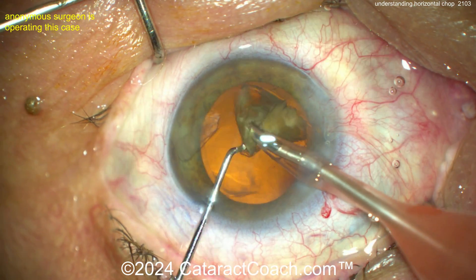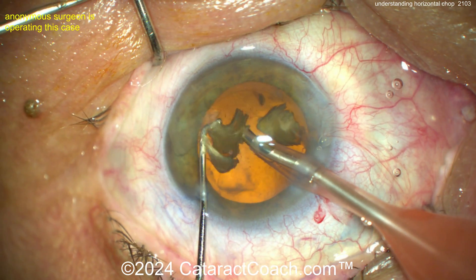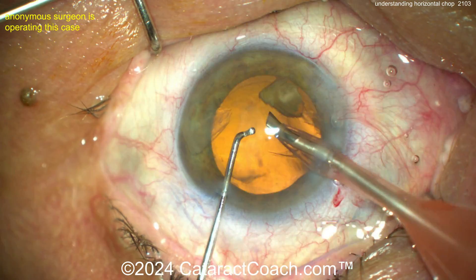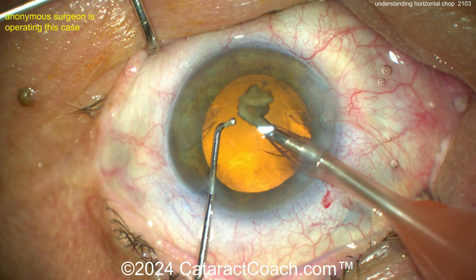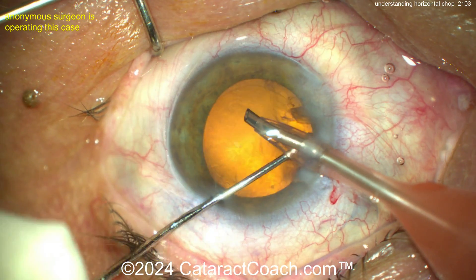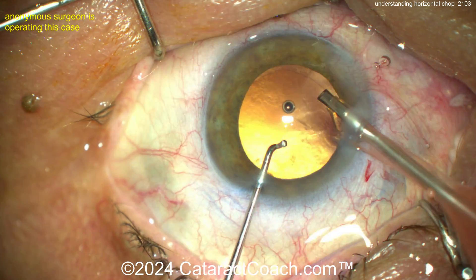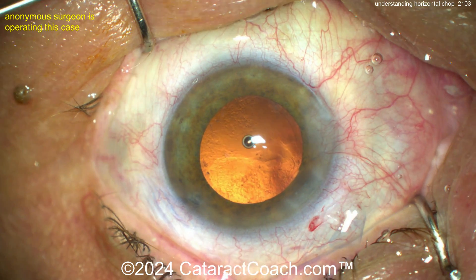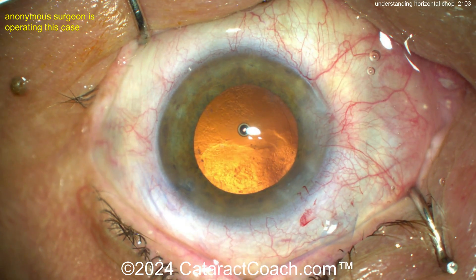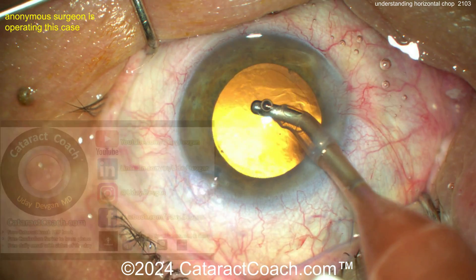There is a time constraint with horizontal chop. When you buzz in with the phaco probe — position one, two, three — you buzz into the center of the nucleus, get the tip occluded, hear the ding ding ding on your machine, then retract your foot to position two. You have maybe a window of one to three seconds to accomplish the chop while you still have the vacuum holding power. If the nucleus has any degree of softness, the seal breaks, vacuum drops, and it becomes much tougher to chop.